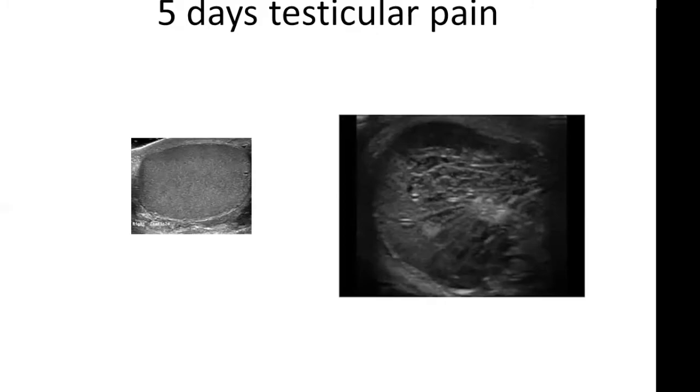The testicle is often in an abnormal plane. I've seen a twisting of the spermatic cord or the snail shell sign, and then a grossly abnormal enlarged testicle which is of different echogenicity from the normal testicle, and the breakdown of the connective tissue due to infarction.